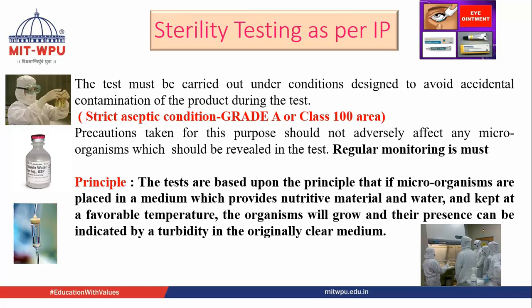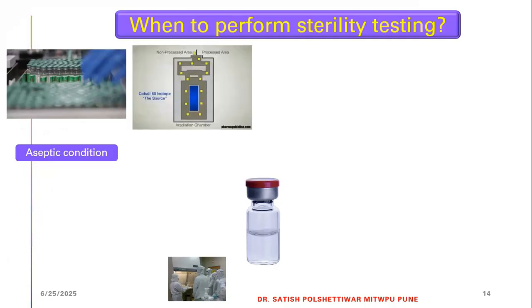And precautions taken for this purpose should not adversely affect any microorganism, which should be revealed in the test. So regular monitoring is very important. And now the next part: when to perform the sterility test.